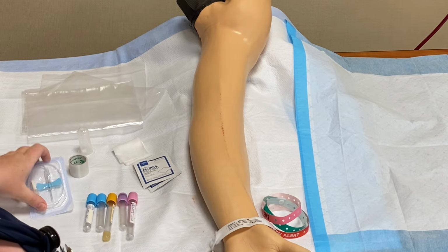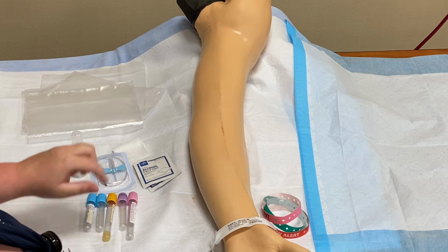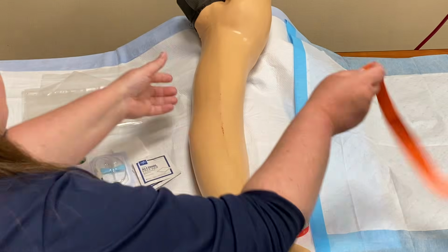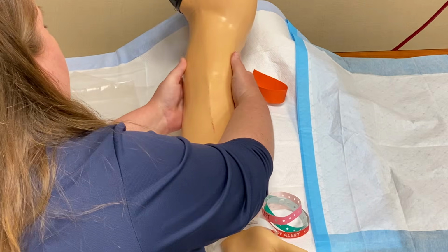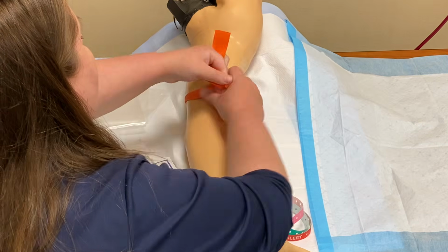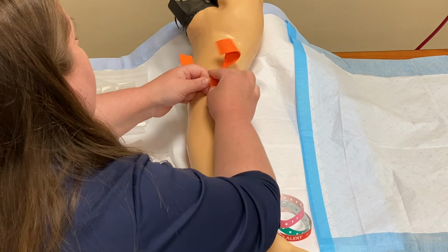With my butterfly Vacutainer method, I'm probably going to aim somewhere for the forearm. So I'm going to put my tourniquet under her elbow, and I'm going to tie it tight enough to let the blood pool, but not so tight that it is really hurting her.